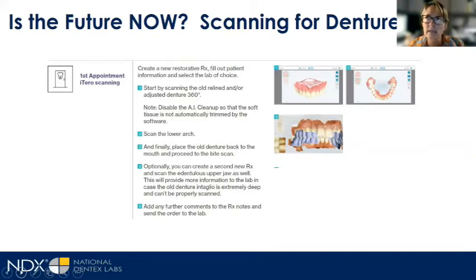And part of the reason for that is the scanner is not picking up the color of the tissue, it's picking up topography, right? So the little nooks and crannies of the oral cavity. Recent extraction sites actually scan really well. If the patient has well-developed rugae on the maxilla, that's very helpful in scanning.